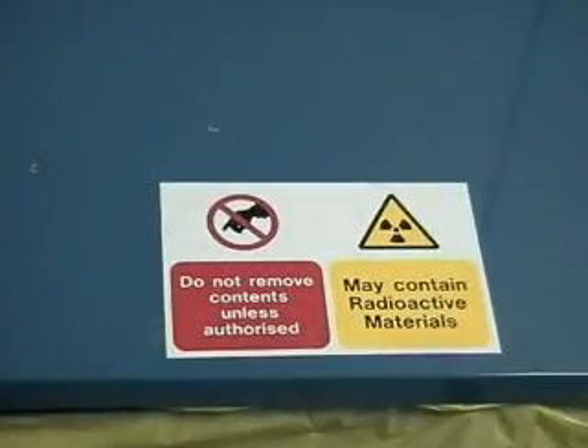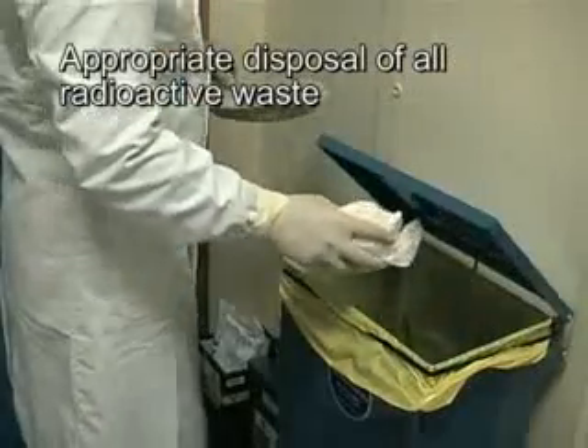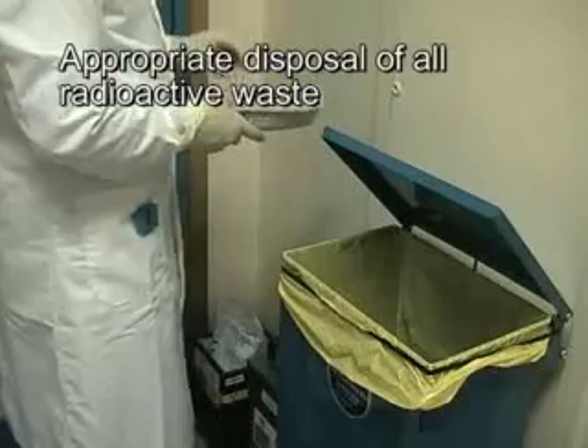Proper disposal of contaminated radioactive waste is extremely important.